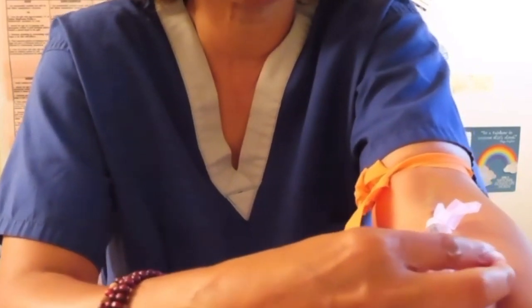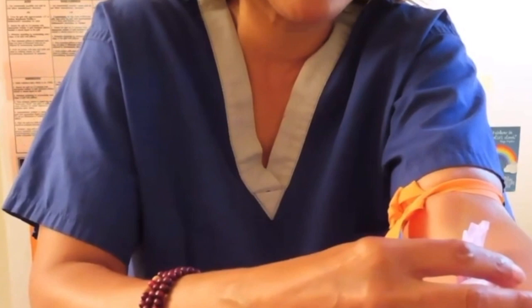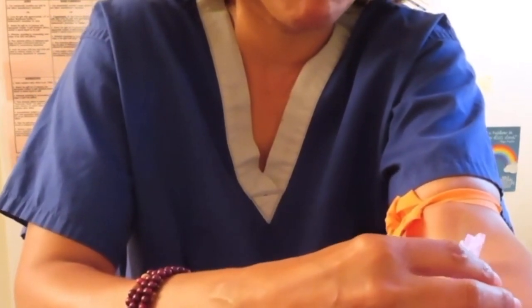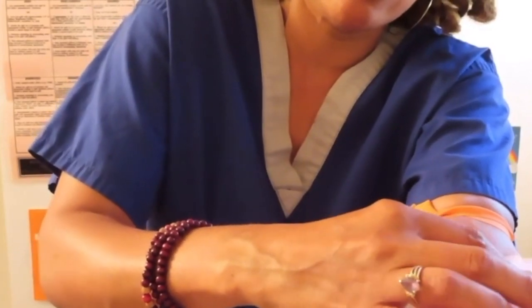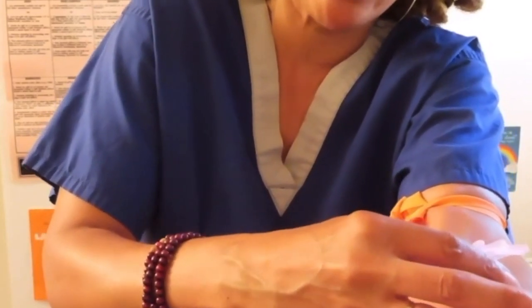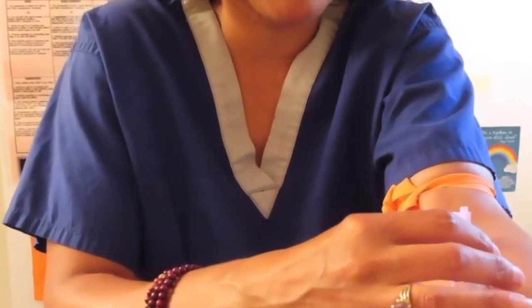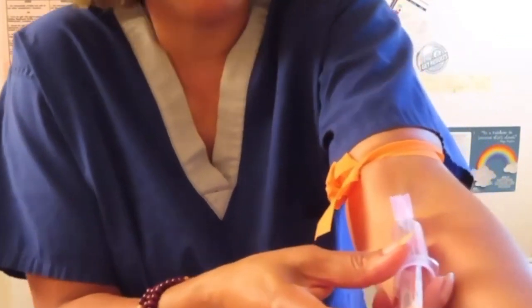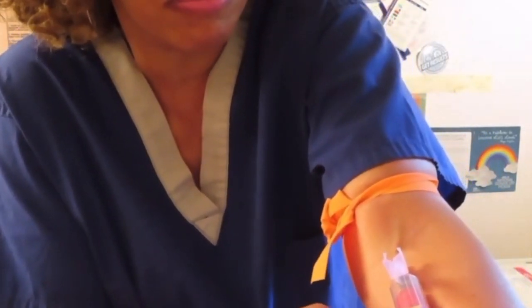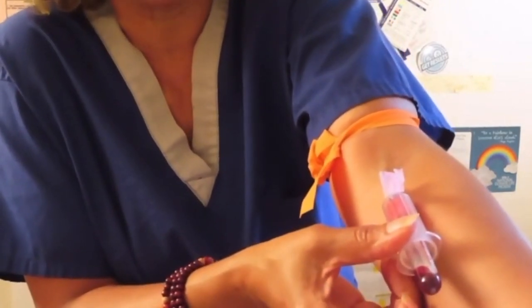And with your straight needles, you don't have to worry about any interference or pretty much anything, because it's straight from the vein. I'm sorry, you guys, I'm trying to adjust. Right into your tube. And once you're in your vein, you puncture your tube and you get your blood.